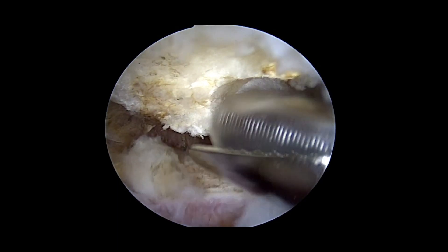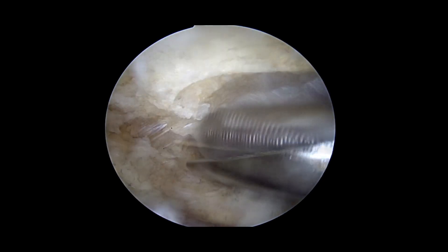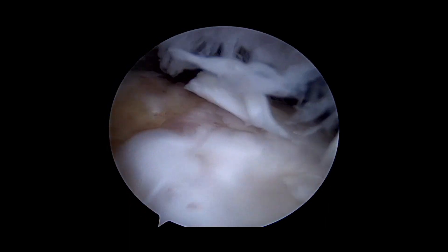We've gone into the subacromial space. Viewing from the back, we've taken off the coracoacromial ligament. We're now doing an acromioplasty to remove the spur. Viewing from the mid-lateral portal, we can see the tear and the exposed footprint.